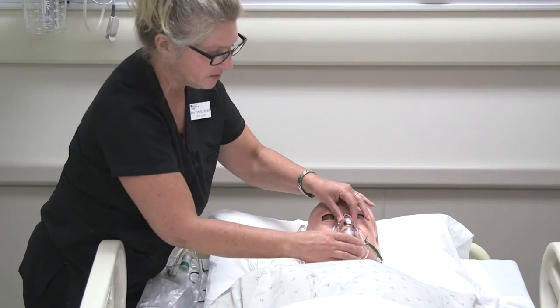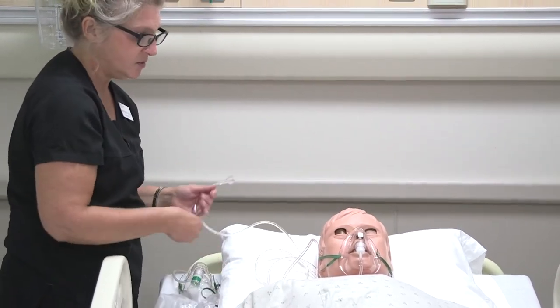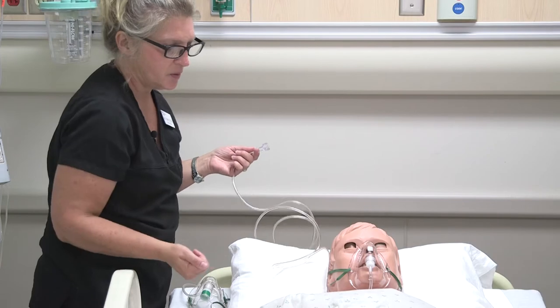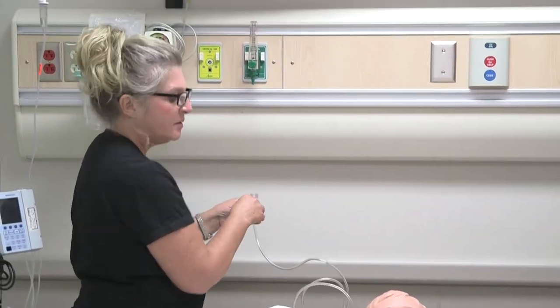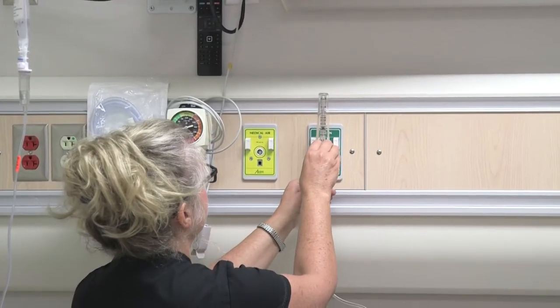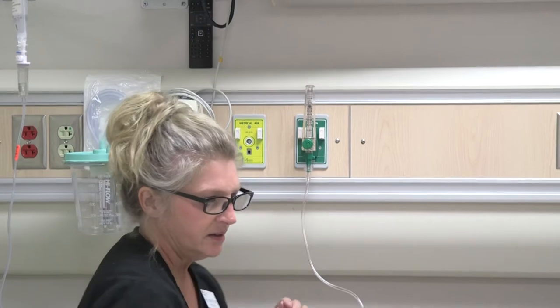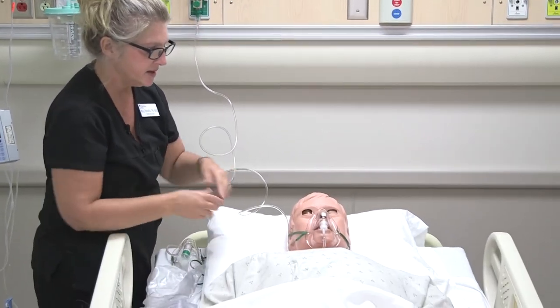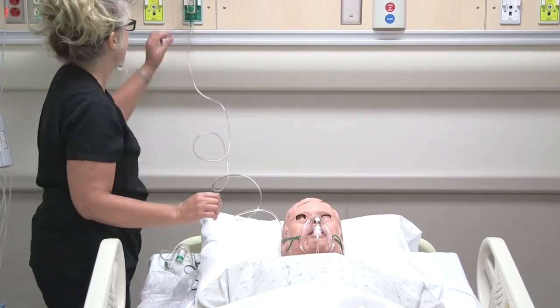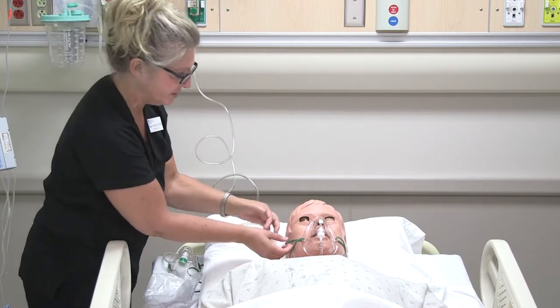You want to make sure that it's covering the mouth. If this type of delivery system matches what the provider wants for the patient, it's a good one for mouth breathers because you can get the oxygen right in there, or if the nasal cannula isn't appropriate. I'm going to set this one at six right there. You can tighten it on the sides as well if needed. Always want to assess for skin breakdown with these oxygen systems, because skin can break down if they're wearing them for a while.